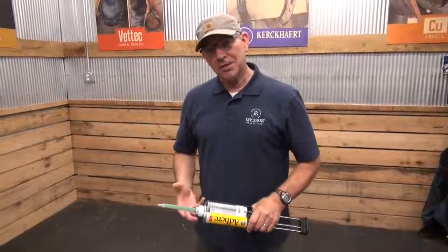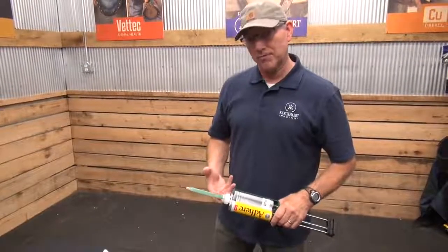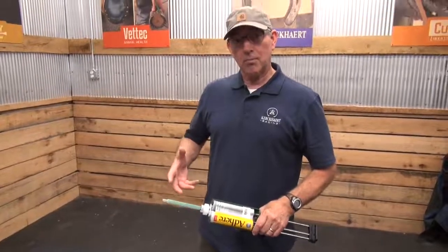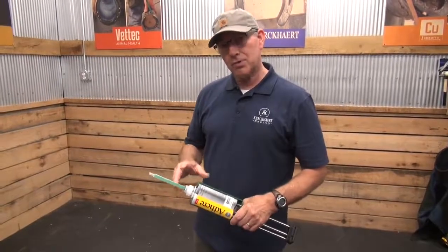So unfortunately, we don't work on horizontal surfaces that often on horses' feet. Much of the time we're working on a vertical surface. And so that makes it much more difficult to control where the material goes, because it tends to want to slump down towards the ground. So I'm going to show you how to do that.